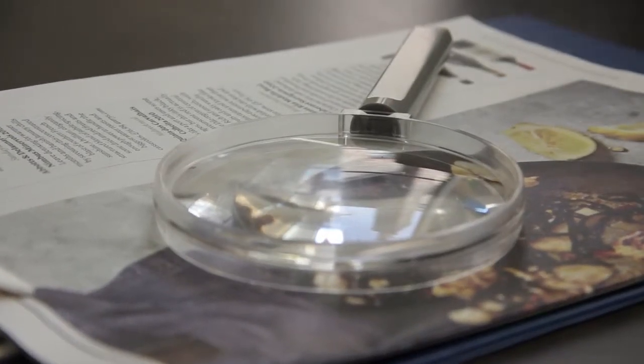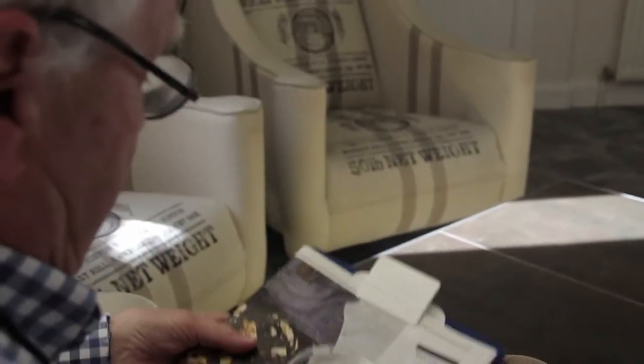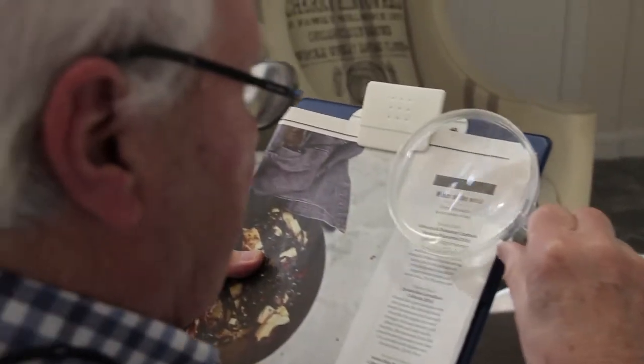This is a lightweight, low-cost magnifier, and in use with a clipboard, it is a very useful tool. My name is Reg Arnfield, I'm 84 years old, an ex-airline pilot, and I've had macular degeneration for 20 years.